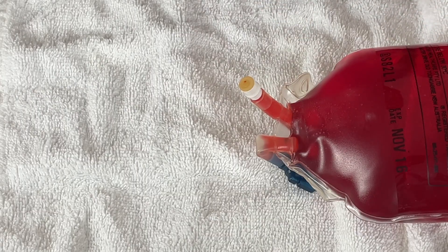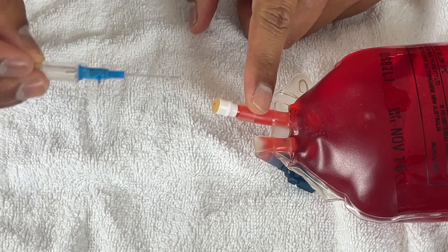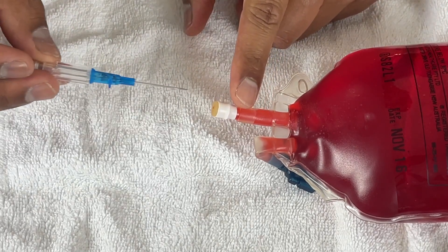To demonstrate this, I've got a normal 22 gauge cannula. I've got a bag of CSL - compound sodium lactate - with some red food colouring in it so it's not blood, and I'm going to pretend that's a vein. I'm going to access it through this port here so that I don't have to access an actual vein, and then we'll see what happens.